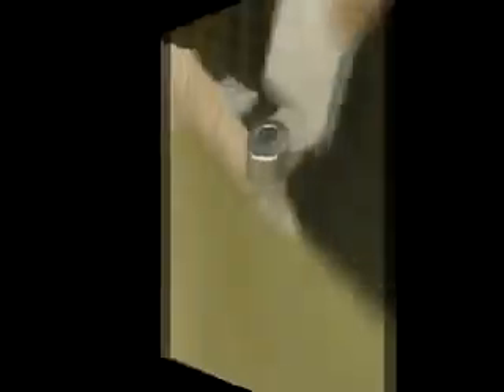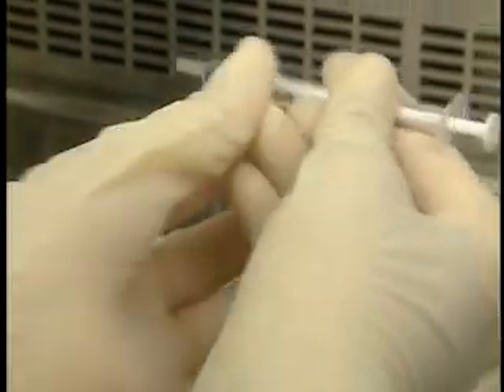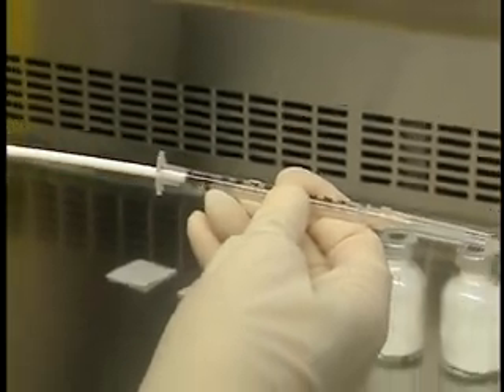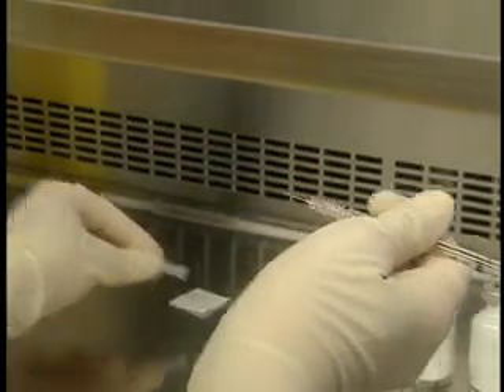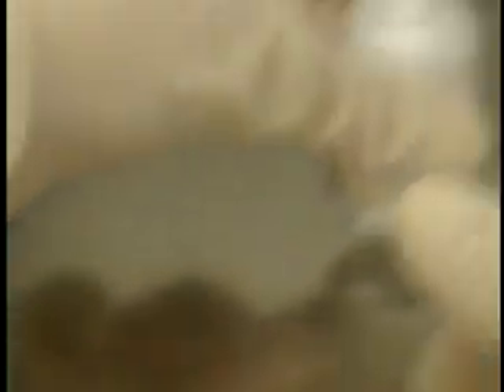Before continuing, let's look at how to install a venting needle in a vial. First, dislodge the powder from the sides of each vial and disinfect the rubber stoppers. Attach a small caliber needle to a 1 milliliter syringe. Remove the plunger from the syringe and discard it with the non-sharp waste along the side of the hood. Insert the venting needle system at a 45 degree angle into the edge of the central circle on the rubber stopper. Now turn the vial so that the venting needle is at 12 o'clock. Raise the needle before reconstitution so that it does not dip in the solution.